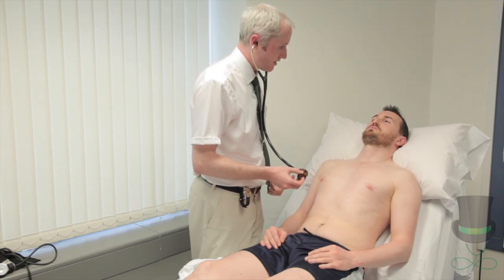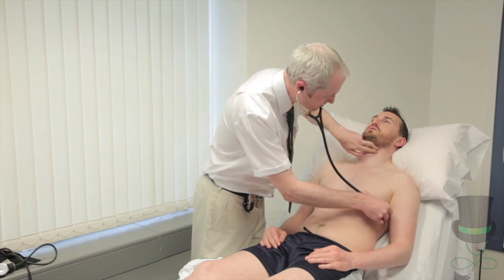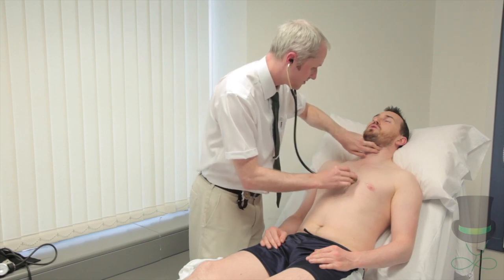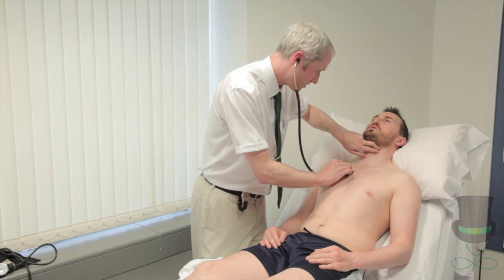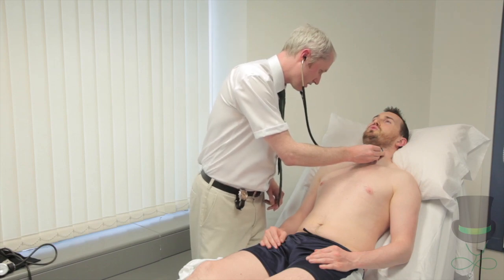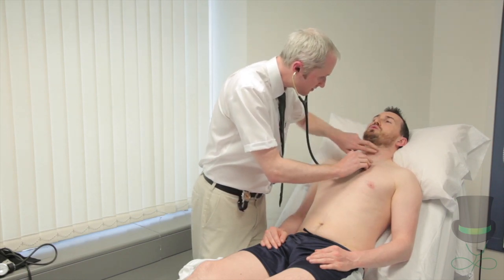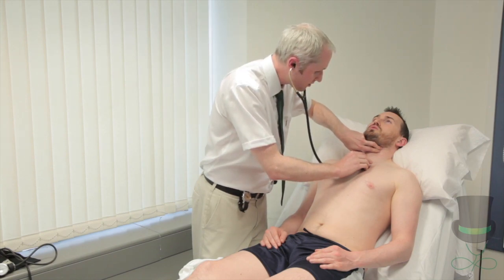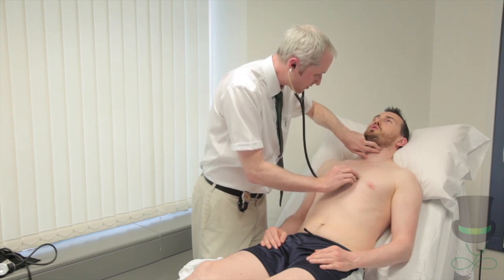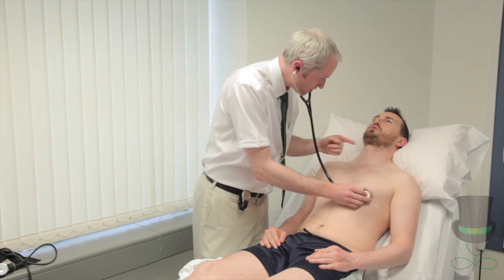Take a breath all the way in, then go all the way out and hold it out. All the way in and hold it in. All the way out and hold it out. All the way in and hold it in. All the way out and hold it out. All the way in and hold it in. All the way out, hold it out.